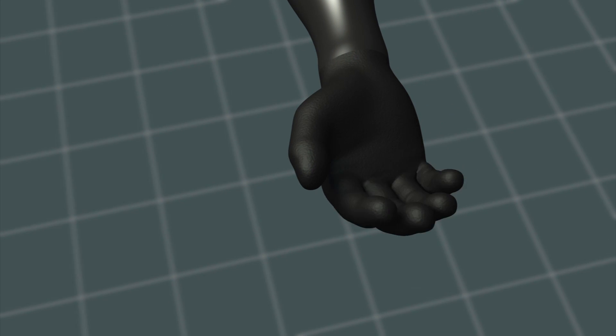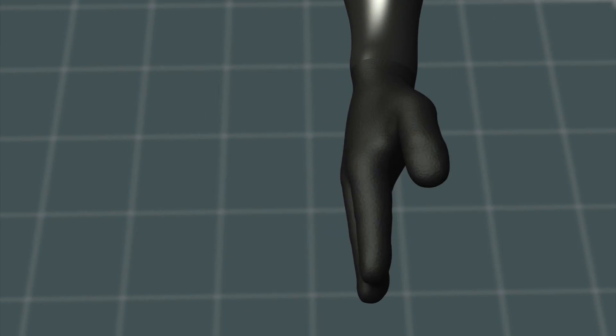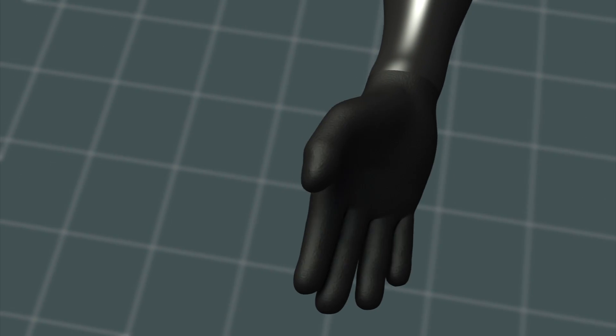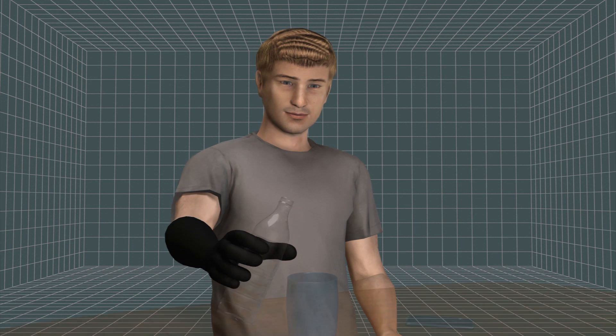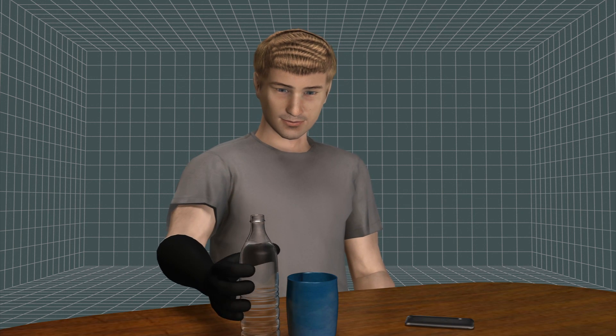The system allows for three degrees of movement: opening and closing of the hand, rotation of the wrist 180 degrees clockwise and counterclockwise, and lateral movement of the thumb — allowing the patient to easily perform daily tasks.